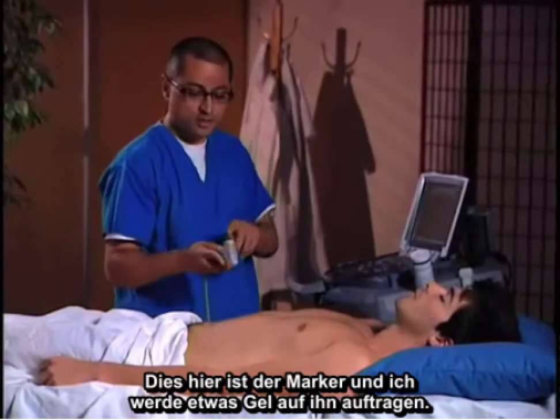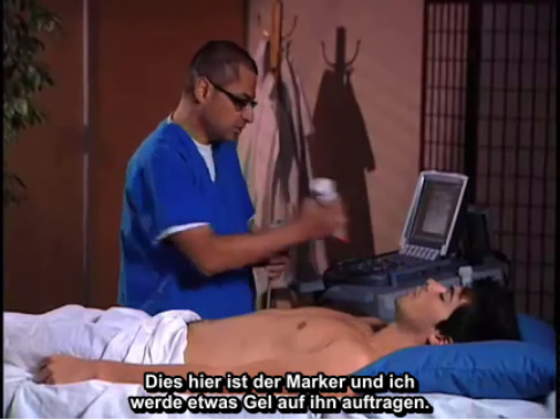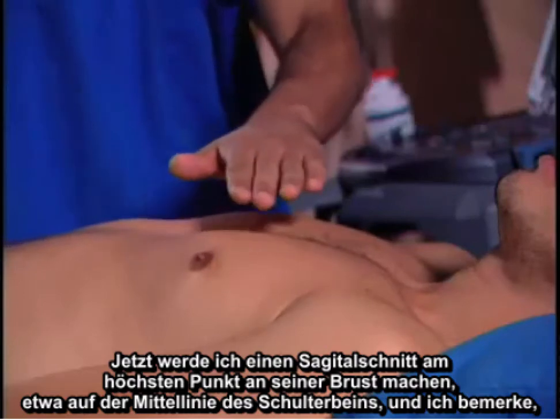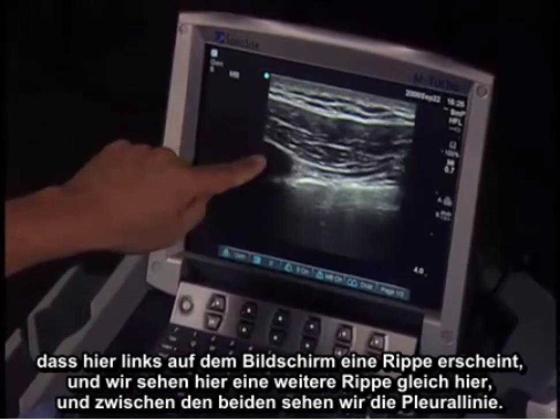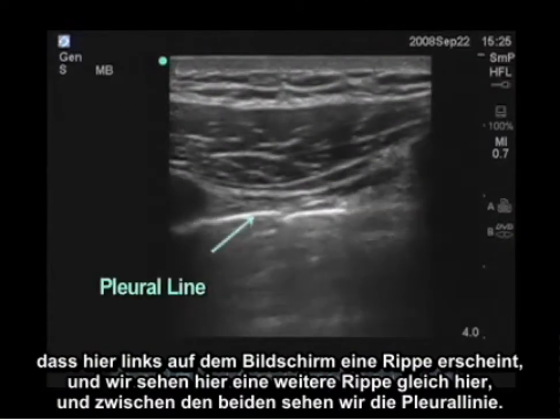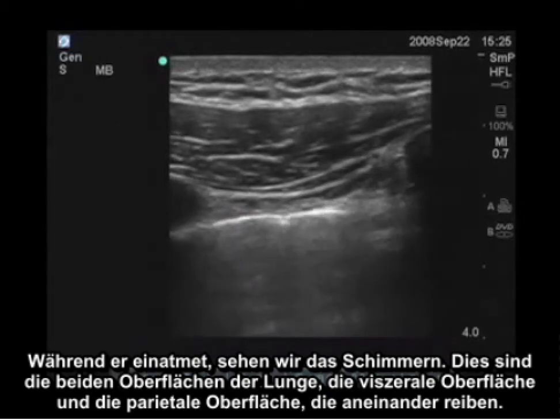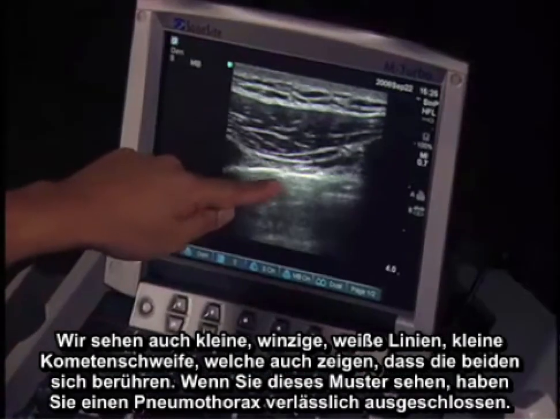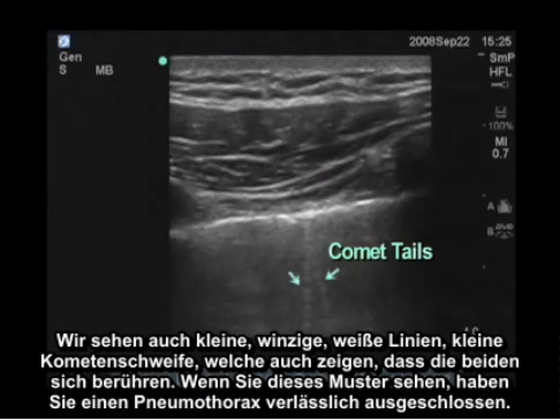Here's the transducer I've chosen — this is the marker here. I'm going to apply a little gel, then scan sagittally at the highest point of the chest in about the mid-clavicular line. I can see a rib to the left of the screen, another rib to the right, and in between the two we see the pleural line. As the patient takes a breath, we see shimmering — those are the two surfaces of the lung, the visceral and parietal surfaces, rubbing together. We also see little tiny white comet tail lines, which show that both surfaces are touching.